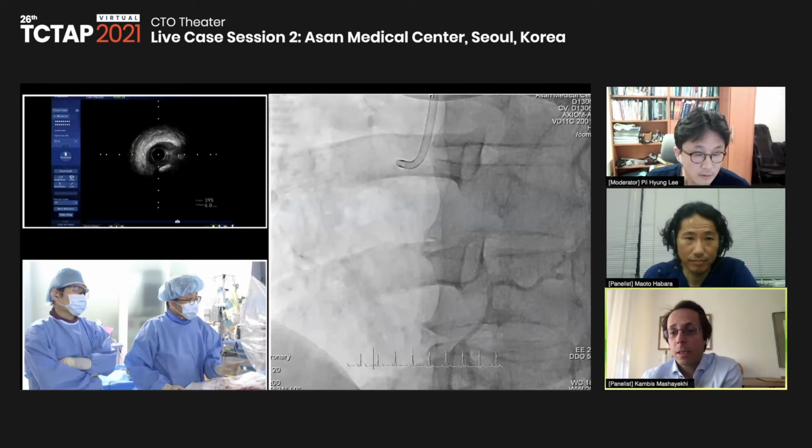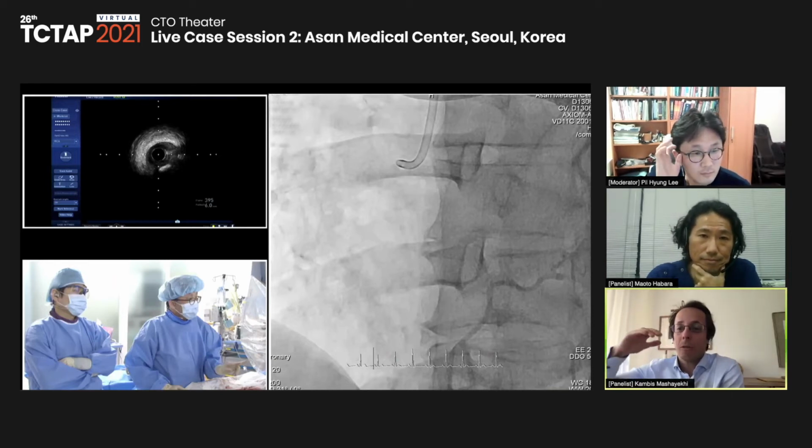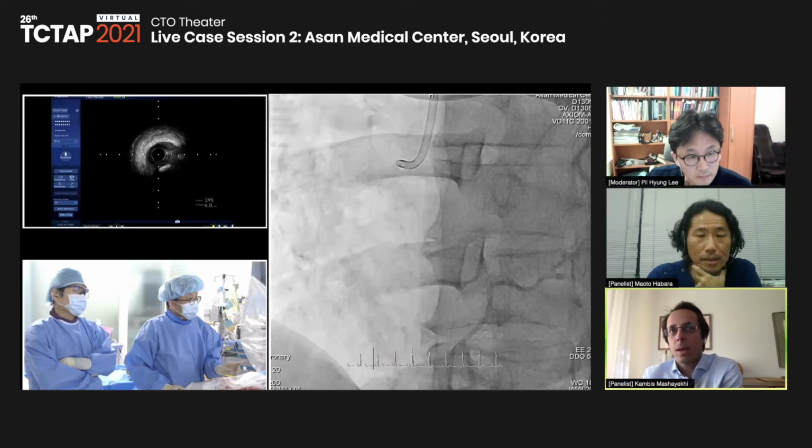So therefore, I ask Dr. Habara, the wire choice of puncture. Still in Europe, we don't have any steel. We don't have the Gaia 3 Next or the Gaia Next. So regarding the deflection, because it's going a little bit down, and we know the behavior of the Conquest 12, which after puncture just goes straight, what is the wire of choice for you in Japan for this kind of scenario?